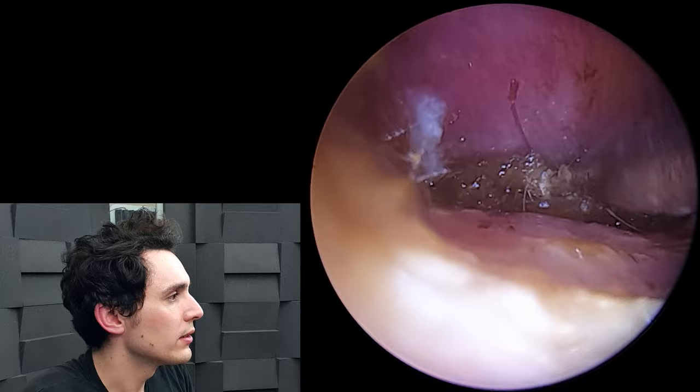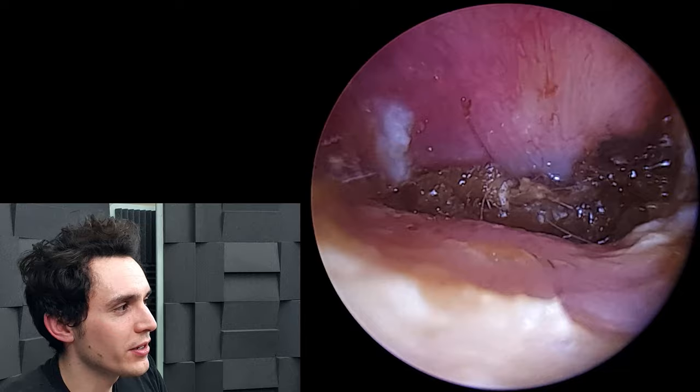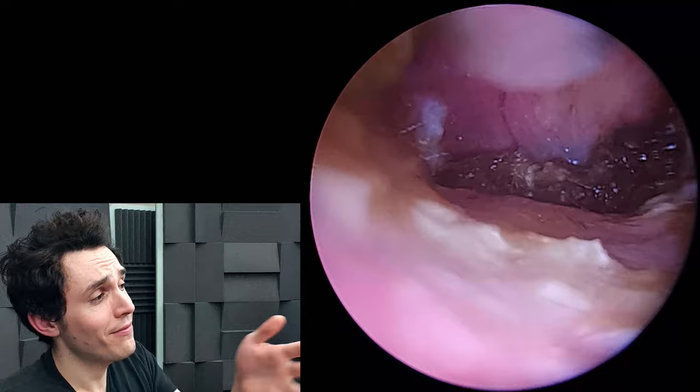I'm just seeing a little bit of movement here but it's really not enough to give me any kind of opportunity. You can see the eardrum just poking through there — it's the slightly grey skin right in the center of the frame. That white debris on the left hand side is just desiccated dead skin, nothing negative.